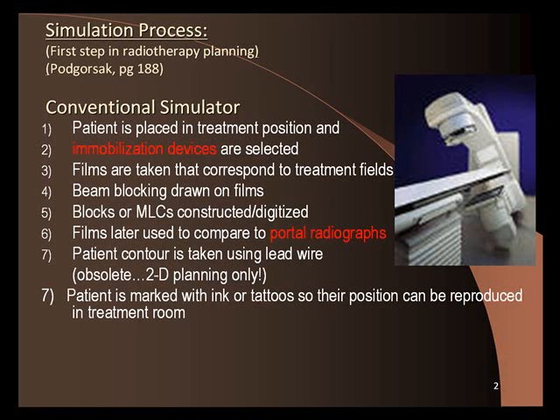Now, before we had CT simulators, we had these things here, which are conventional simulators. That's a really blurry image, but I brought my laser pointer. In a conventional simulator, it looks like a gantry. It looks like a skinny gantry.